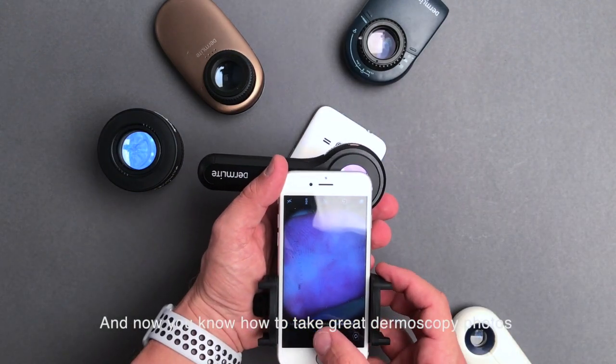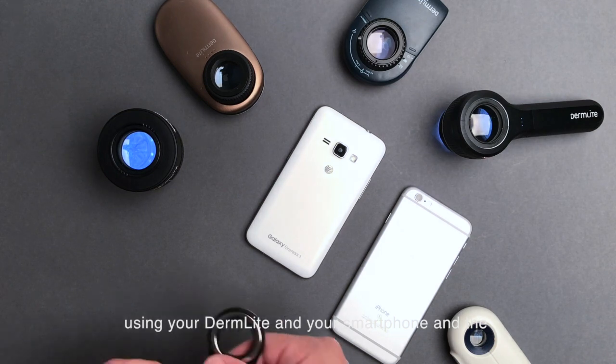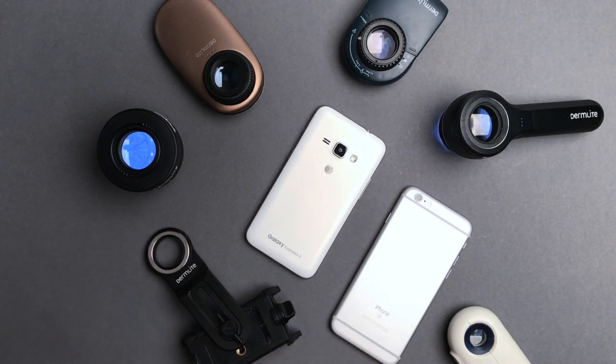Now you know how to take great dermoscopy photos using your DermLight, your smartphone, and the Universal Smartphone Adapter.